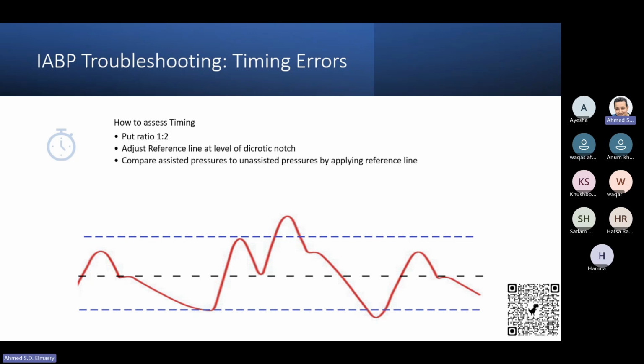because the recommendation for the CPR is to do chest compression between 100 to 120 per minute. If you are doing chest compression at 100 to 120 per minute and you keep the internal mode fixed at 80, that means the intra-aortic balloon will inflate only 80 times. So you will not find synchrony between the chest compression and the inflation and deflation of the intra-aortic balloon.